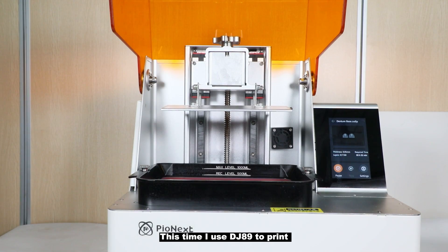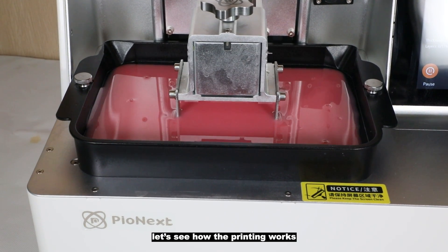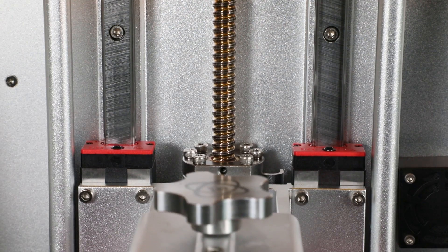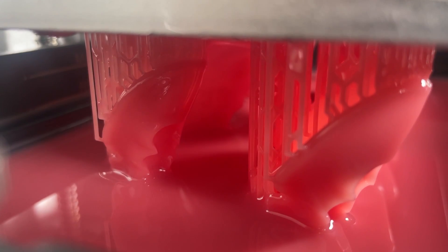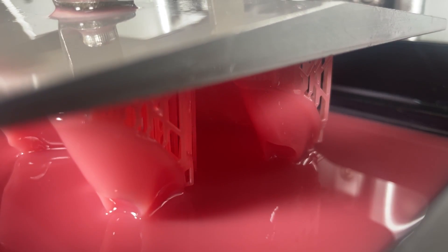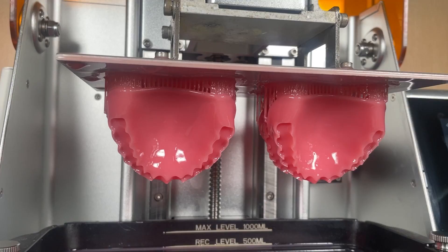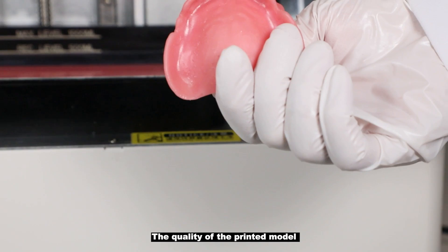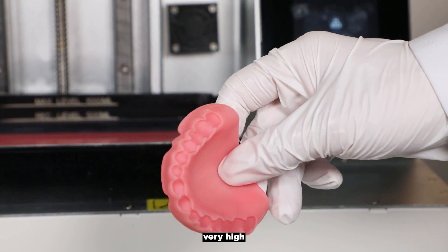This time I use the DJ 89 to print the denture base model — let's see how the printing works. The quality of the printed model is very good and the precision is very high.